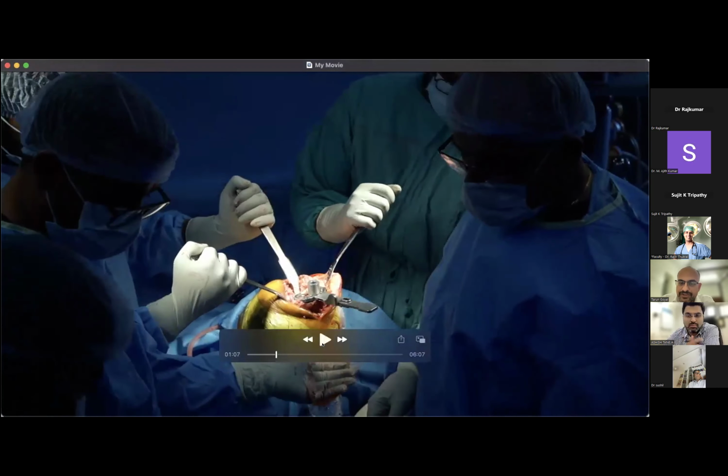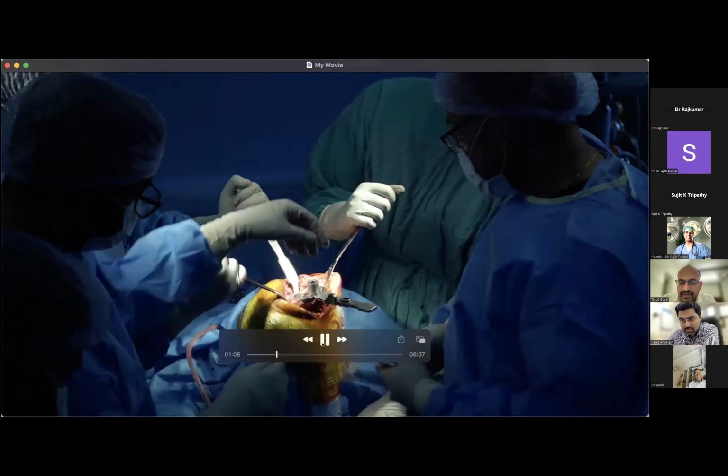So in this tibial preparation, once we have prepared the canal, we will look at whether we need any eccentric components on the side, whether we need any offset components on the side, or is the tibial base plate that you have sized exactly in line with the medullary canal.